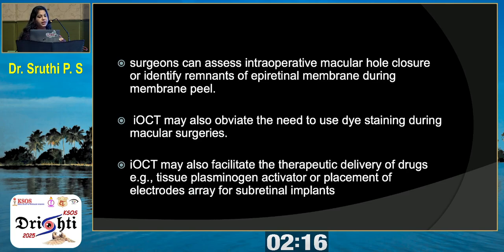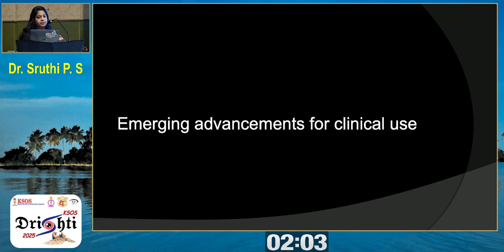IOCT may also obviate the need to use dye staining during macular surgeries. IOCT may also facilitate the therapeutic delivery of drugs like TPA or the placement of electrode arrays for subretinal implants. So, coming to the emerging advancements for clinical use.